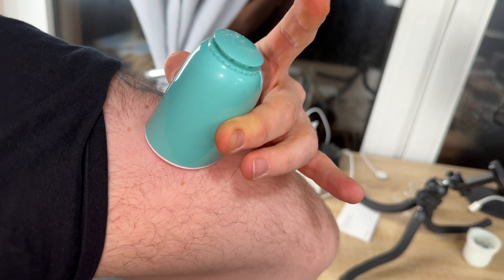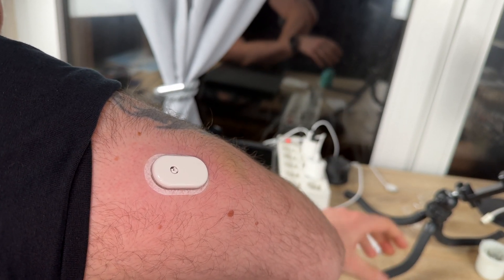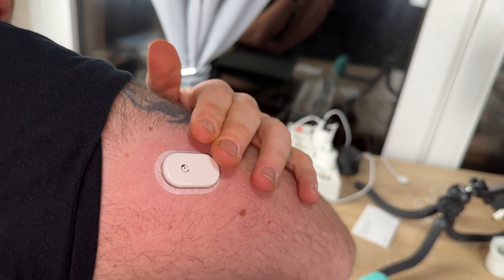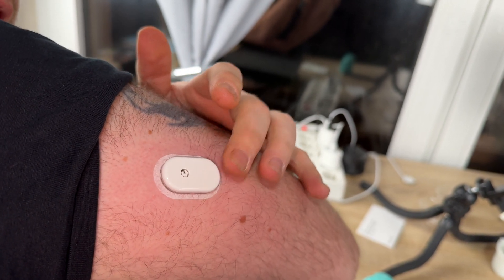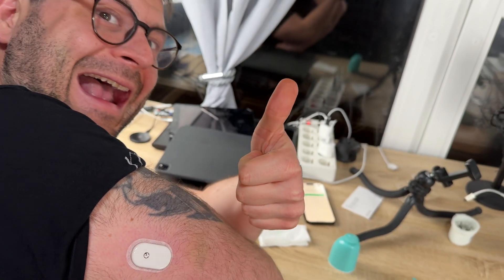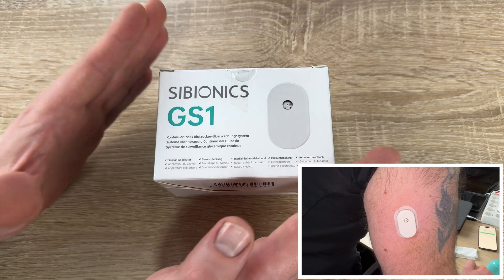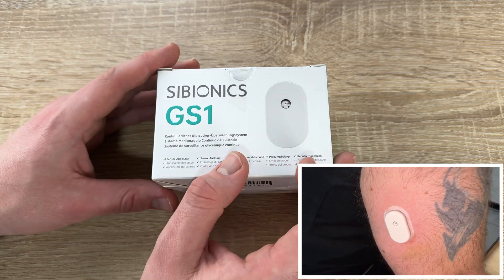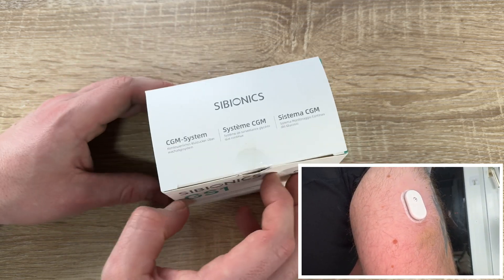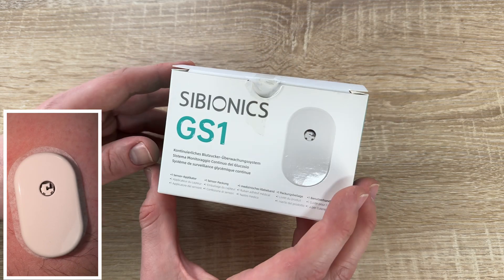Key features include 24/7 non-stop glucose monitoring, real-time glucose readings sent directly to your smartphone, highly accurate sensor readings, 14-day continuous glucose monitoring, calibration free, no scanning, exportable AGP reports, IPX8 waterproof rating, customizable glucose alerts, and a user-friendly app with shareable real-time data. Every moment of life matters — the glucose level may fluctuate, but with this monitoring system and predictive tools we can stay in control anytime and anywhere.